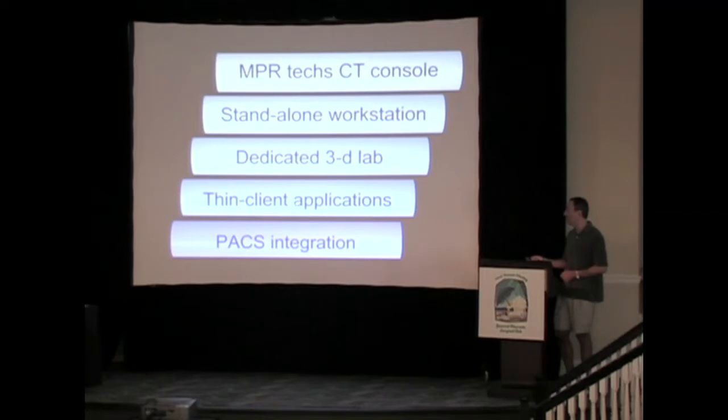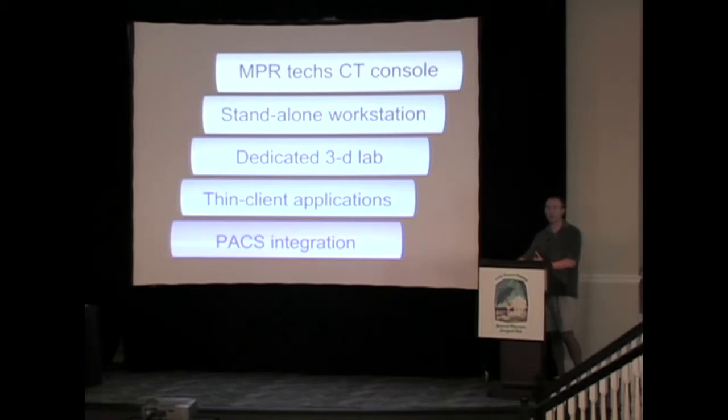One of the newer things that's happening are these thin client applications, which keep the thin section images from the CT, which are best for doing the 3D images, in a separate circuit, so to speak, and they can send those to the radiology workstations. They can also send them to thoracic surgeons, orthopedic surgeons, vascular surgeons, or others so that they can actually interact with them on their own. And then finally, a number of the PACS vendors have started integrating the ability to do multiplanar and 3D images on PACS so that if you're pulling up a case, you can start doing fly-throughs and external reconstructions without having to go to a different type of computer.